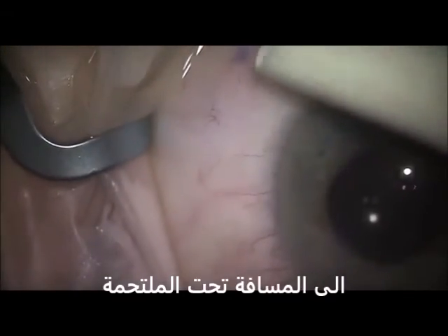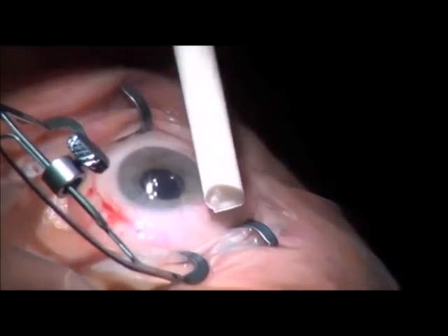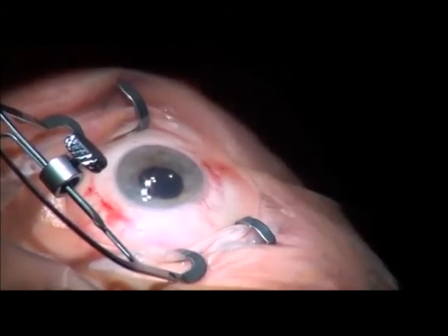Prime the bleb to ensure that there is a good connection between the anterior chamber and the sub-conjunctival space. Notice that a nice bleb is formed after priming. The bleb will develop into a low-lying area of elevation in the post-operative period. Using a gonioscope, you can see that 1 mm of the implant is placed in the anterior chamber to avoid iris or endothelial touch.